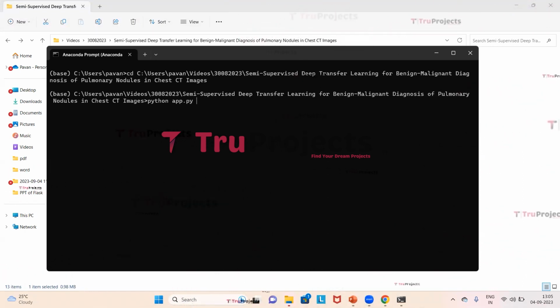This will compile the app.py file using the command which is python app.py in the command prompt, which is Anaconda prompt. This command will execute the Python script and perform a runtime check for any syntax errors or logical issues. Now we'll click on enter.